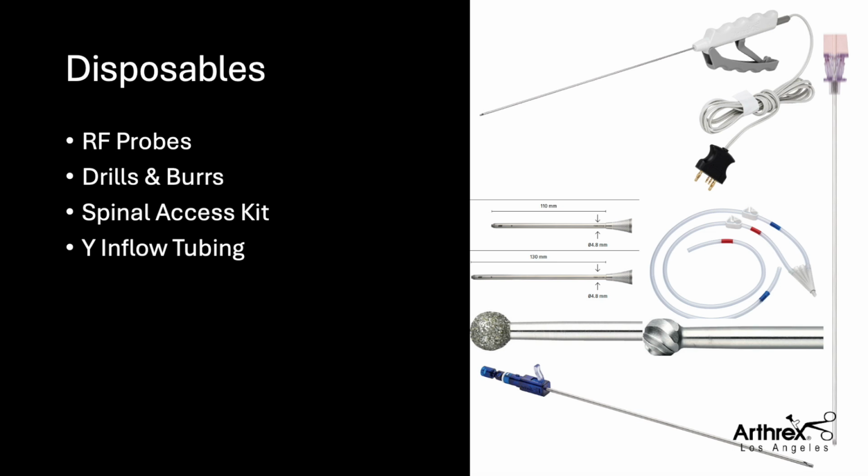Also, when you get to the case the first time, you want to make sure that you have all the disposables needed, just in case you need to call in another one or have someone try to get one for you.